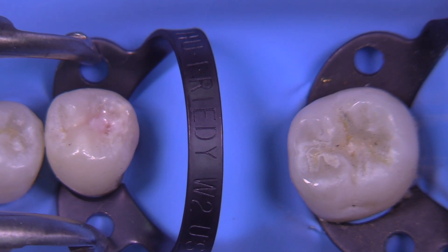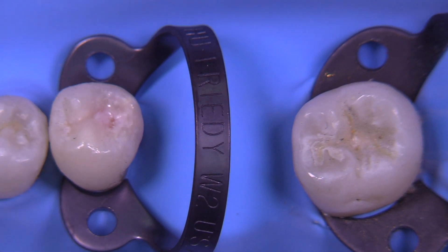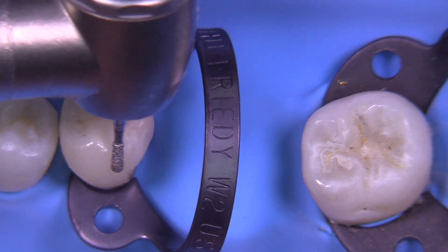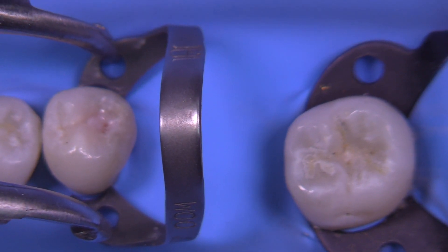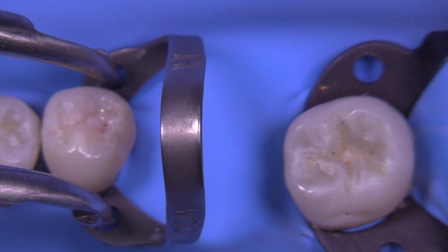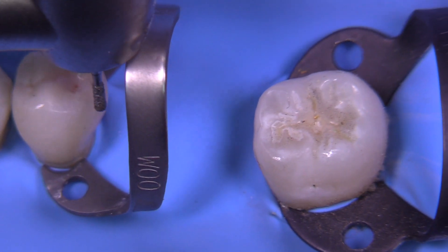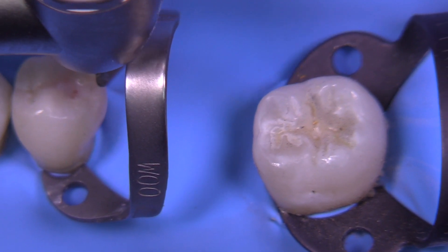One might argue you don't need a clamp at all, but we'd like to see if we can get a little more stability of the rubber dam. The problem with the W2 is we just can't get the handpiece back into the area that we need to work on. Let's try a double zero — a W00 — and actually this is even worse; we can't get access at all in this particular area.